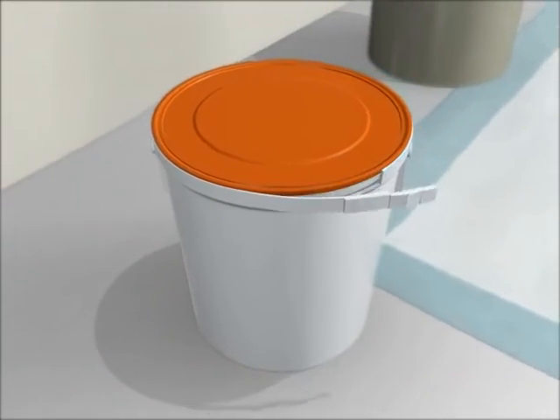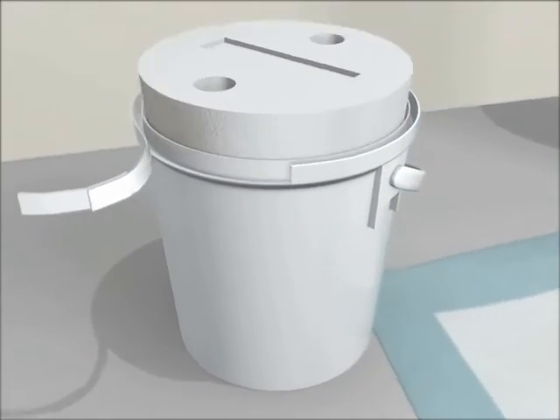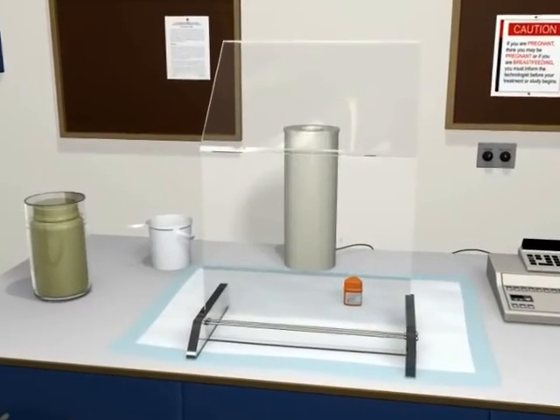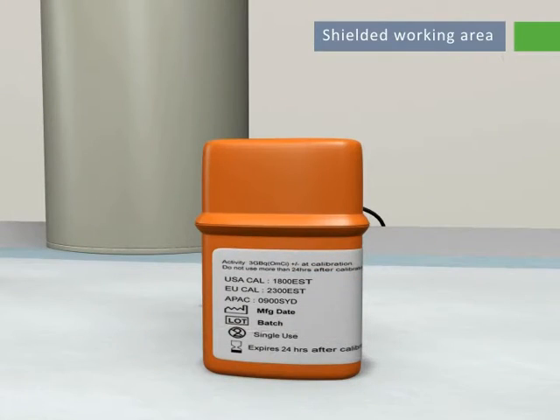Unpack SIRSpheres microspheres, leaving the glass shipping vial in its lead pot, and place it behind the L-block on the benchtop. Record the batch number and calibration date and time.